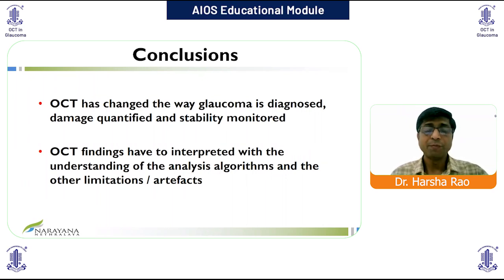So to conclude, OCT has changed the way glaucoma is diagnosed, glaucomatous damage is quantified, and stability or progression is monitored. However, the OCT findings have to be interpreted with the understanding of the analysis algorithms and other limitations of OCT and the presence of artifacts which can make our interpretation erroneous at times.